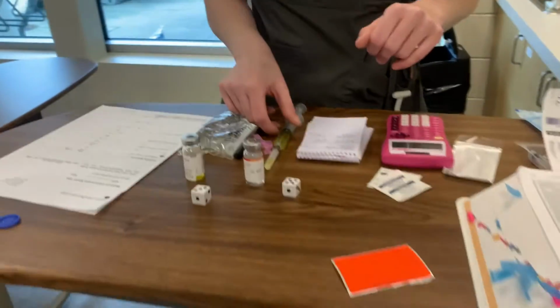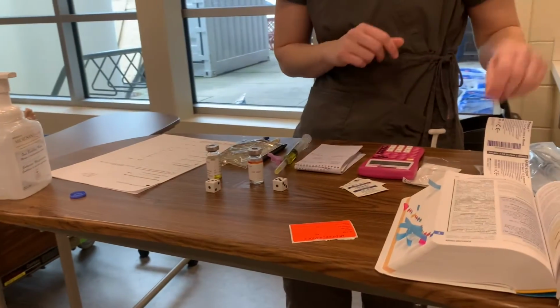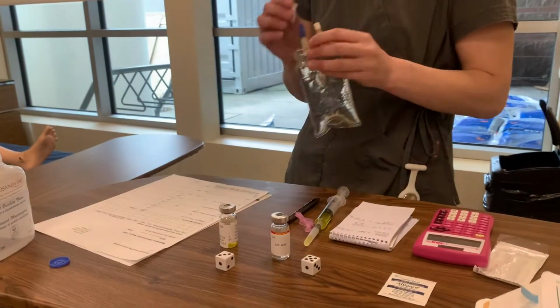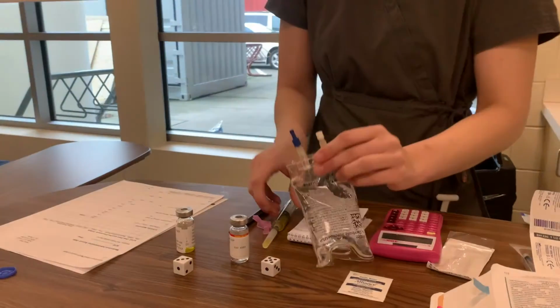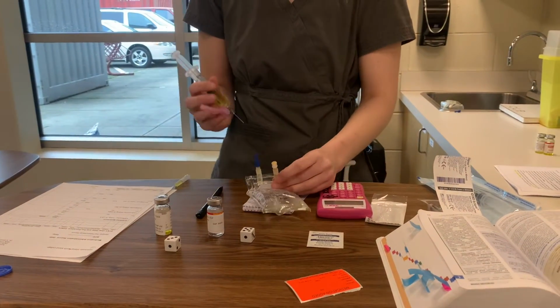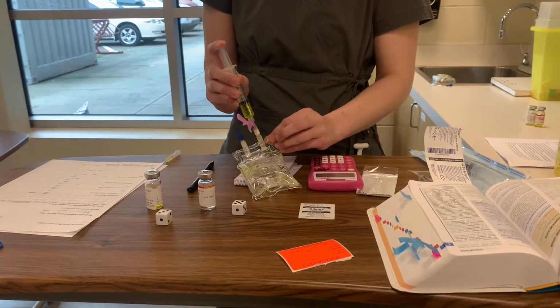So now that my second check is done, I am going to go ahead and inject this into the mini bag. I'm going to make sure I sterilize this port here first. And we're going to go in like this. So that's there, and I have my 5.3 dose here. We're going to go ahead, careful not to stab the side of the bag or ourselves, of course. Inject it into here.